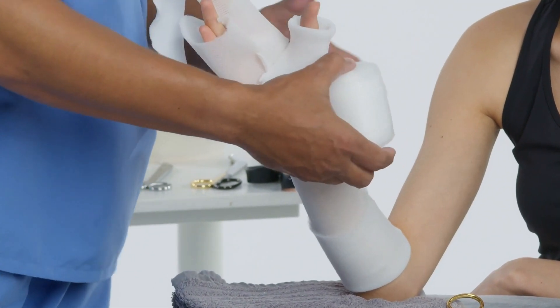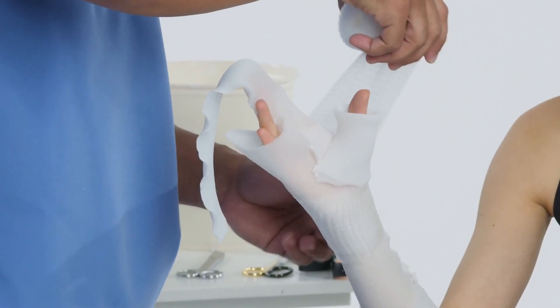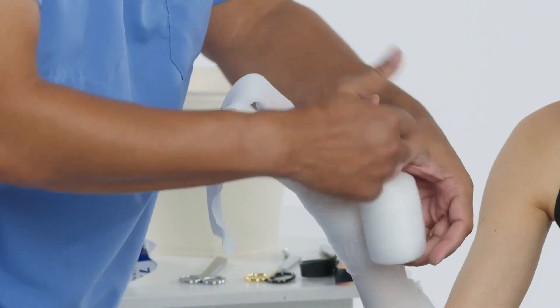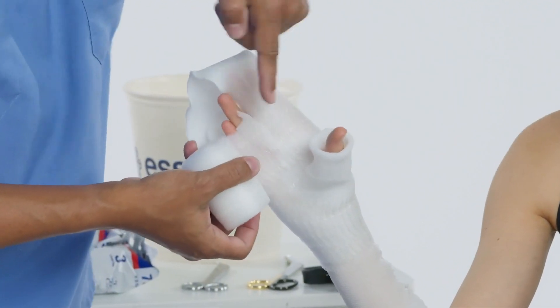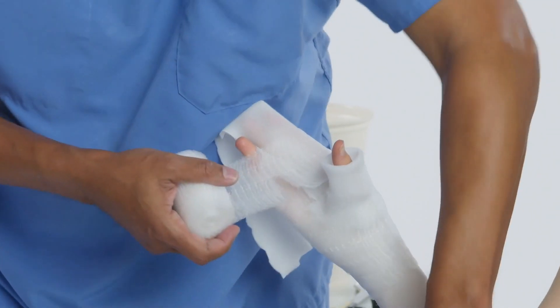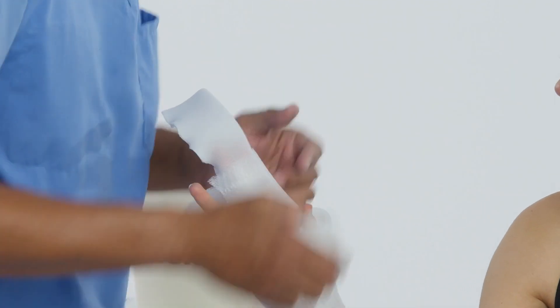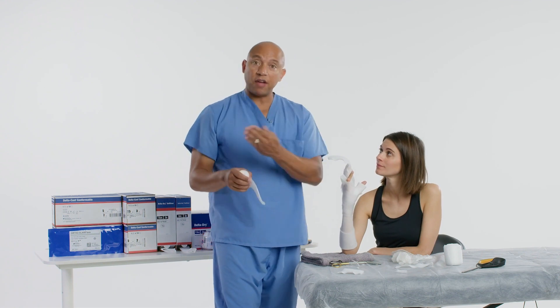I'll start at the wrist and work my way up to the hand and take care of the fingers. With the padding, you cut it like cast tape. As I go up to the fingers, I'll cut where the ring finger is so I know to go between the fingers. If you have an area like a bony prominence that sticks out, go ahead and fan fold the padding on top of itself.